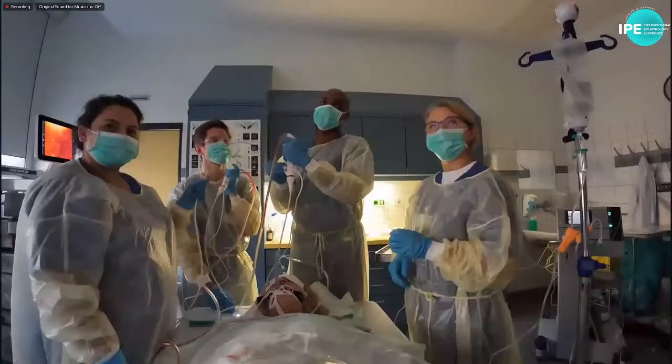And here, this is the video I was talking about, the tandem debulking. It's a patient who has a tumor on the right upper lobe. So I'm in charge now of taking the biopsy, while my colleague to my right in the video is in charge of the hemostasis. So it went this way.